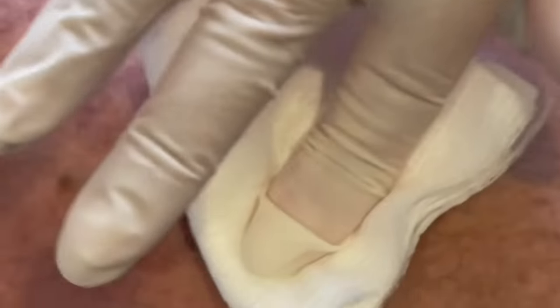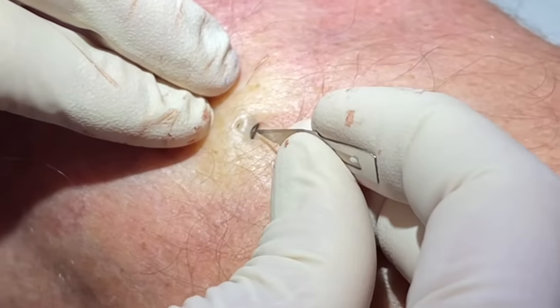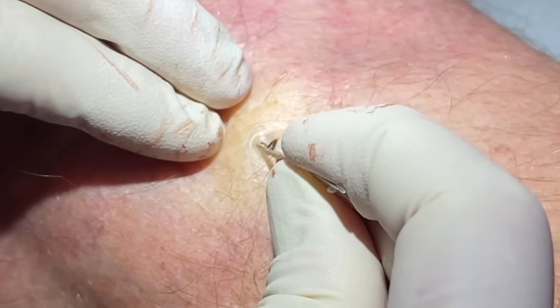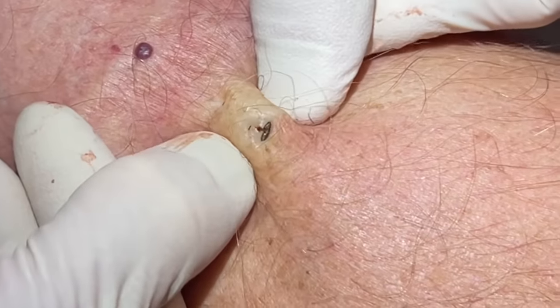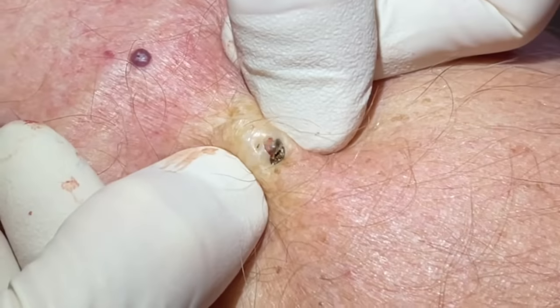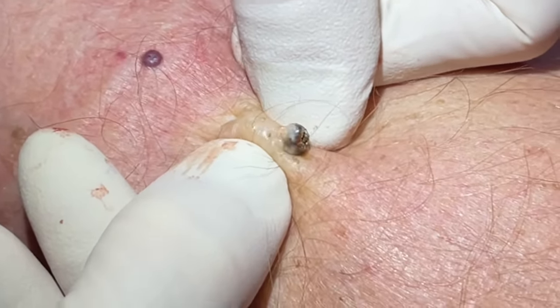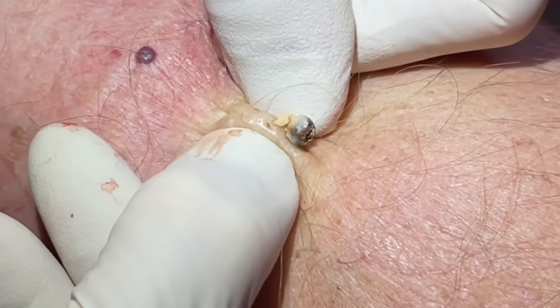Very good. We'll make a little cut right here just to loosen that skin a little. You can usually do a finger squeeze on these. There we go — there's a nice deep blackhead here, kind of a dilated pore. No pain? Nope. Good, you're doing great.